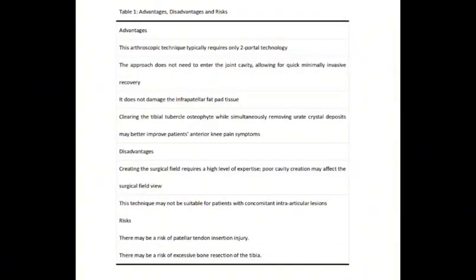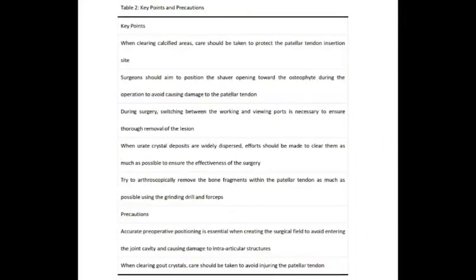Table 1 introduces the advantages, disadvantages, and risks of the technology. Table 2 introduces the key points and the precautions of the technology.